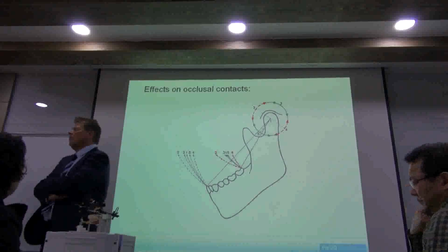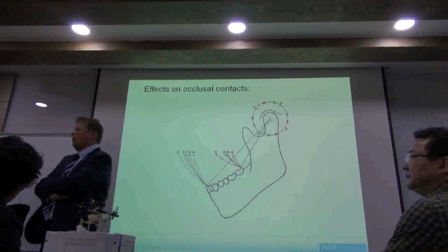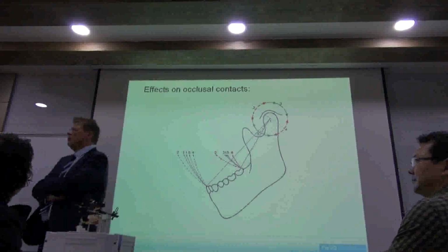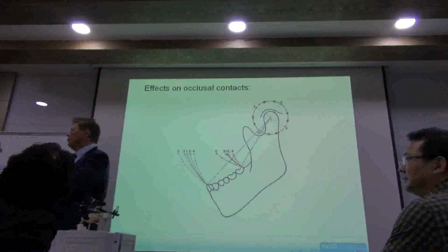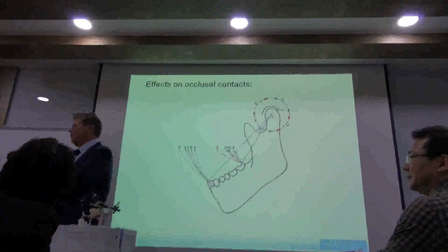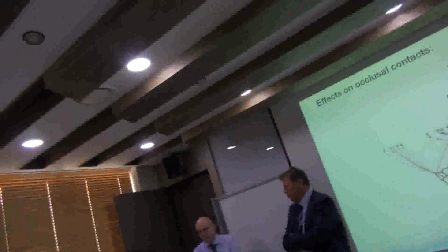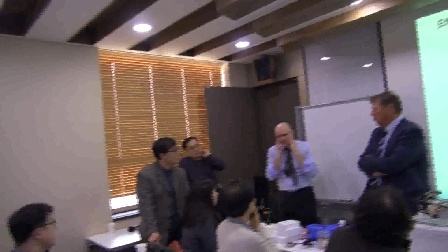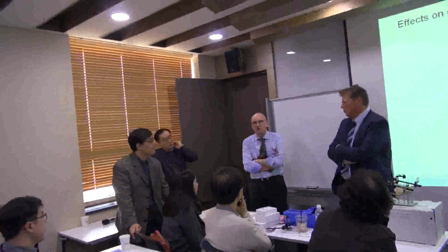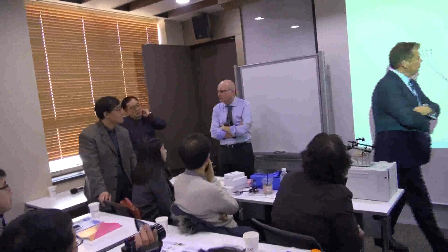From a patient, the hinge axis sometimes changes when you measure each time, then it is the true hinge position. Yes, spatially it can change. Yes, it can change. This is biology. Of course there are maybe some changes, but not very much.